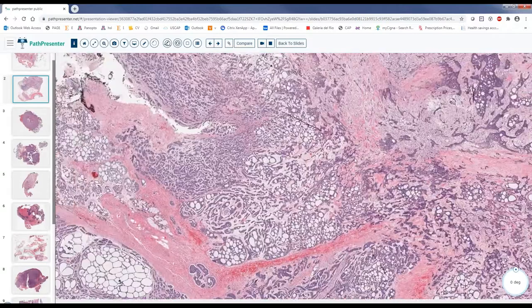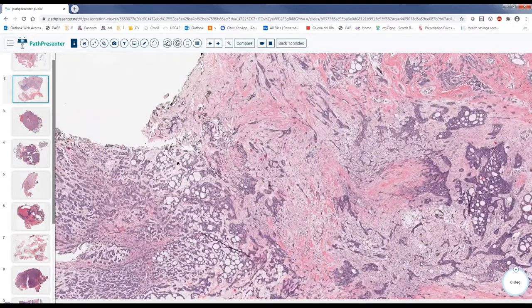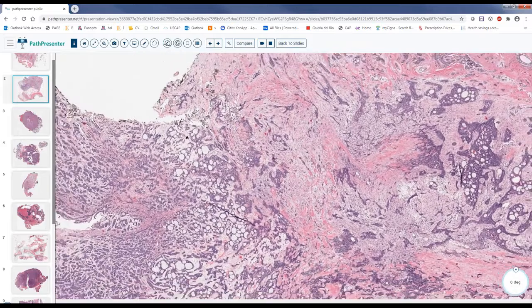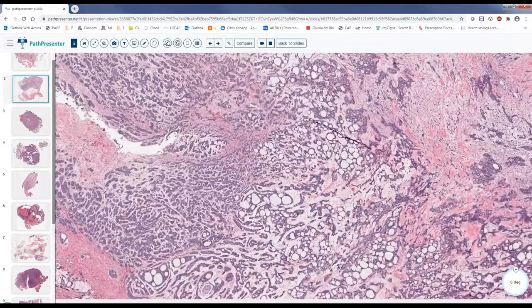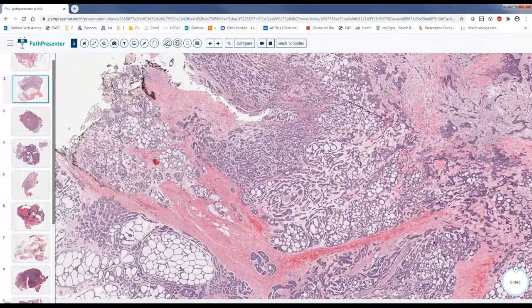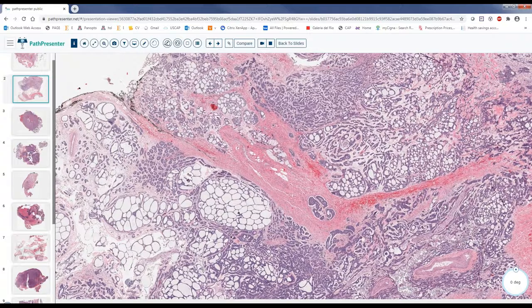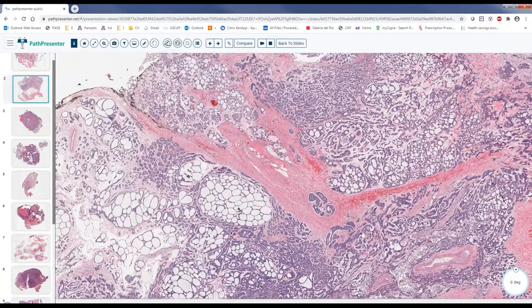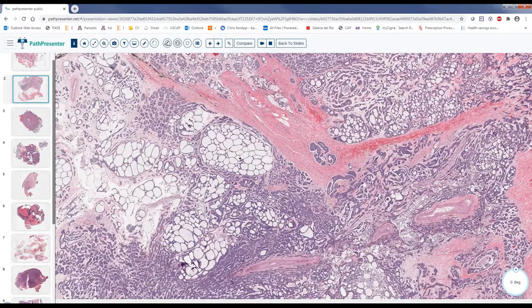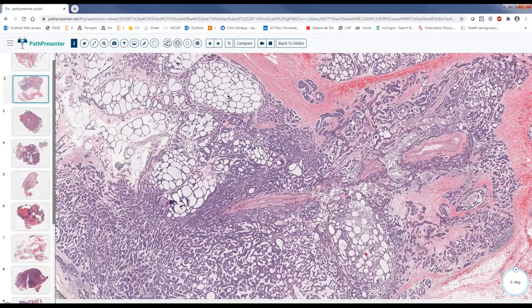Okay, all right. So we see some myxoid stromal proliferation, which is a differential diagnosis for lesions like cellular pleomorphic adenoma. So keep in mind cellular pleomorphic adenoma and adenoid cystic carcinoma. Overall, there is the solid area and the trabecular pattern, and the cribriform growth pattern is also common that we see here. It is cribriform. Okay, all right.